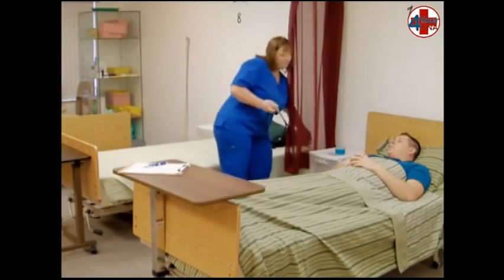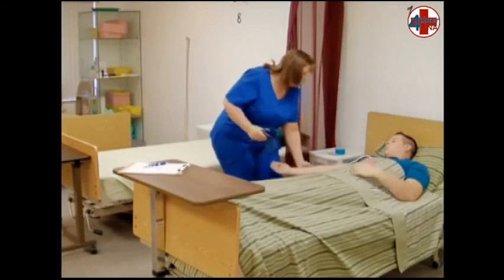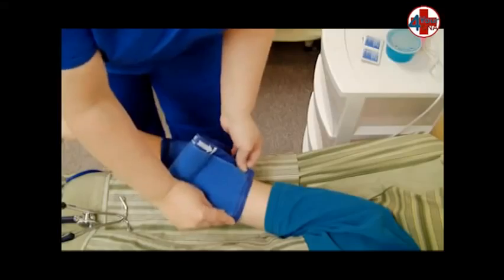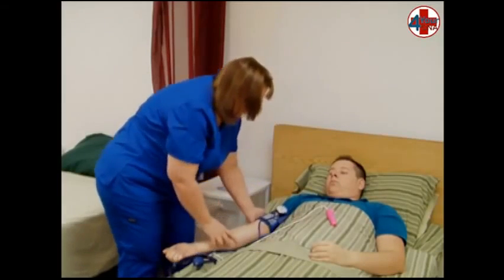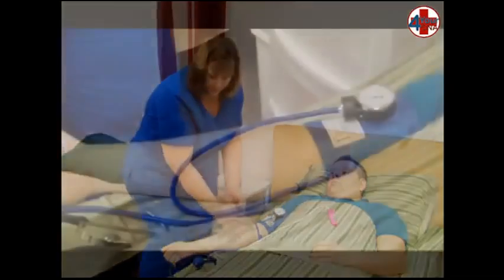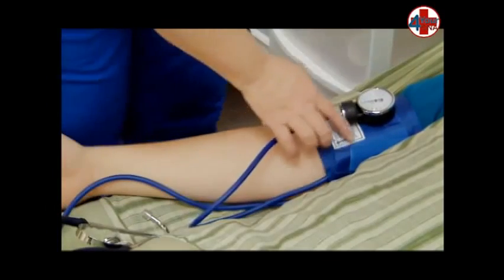Ask the patient which arm he would prefer for blood pressure. Ask him to extend his arm, palm up, and make sure it is supported by the mattress. Measure the cuff by laying the narrow end of the blood pressure cuff over the arm and making sure it covers one-third to one-half of the circumference of the arm. Wrap the deflated cuff around the upper arm at least one inch above the fold of the elbow. The cuff will be secured with velcro as you wrap it. The gauge should be facing you. Make sure the tubing is not kinked or under the cuff, and identify the arrow that will point to the brachial artery on the lower edge of the cuff.